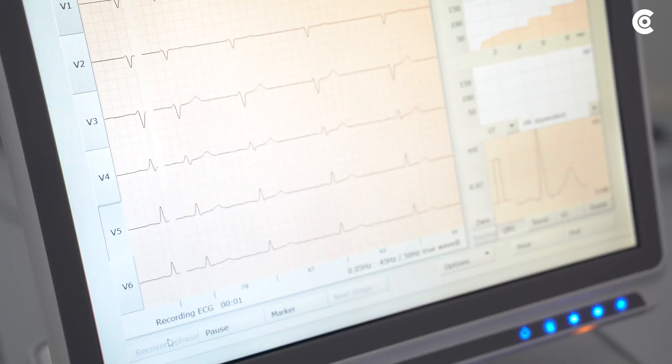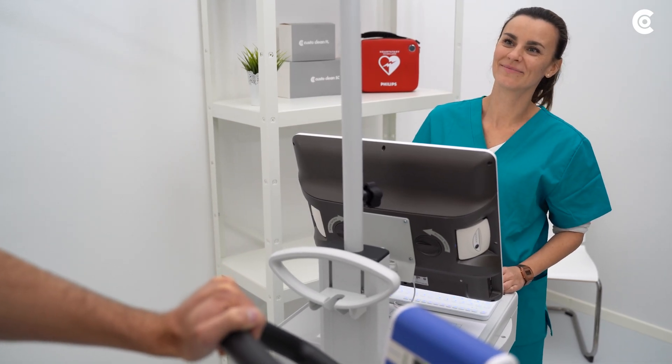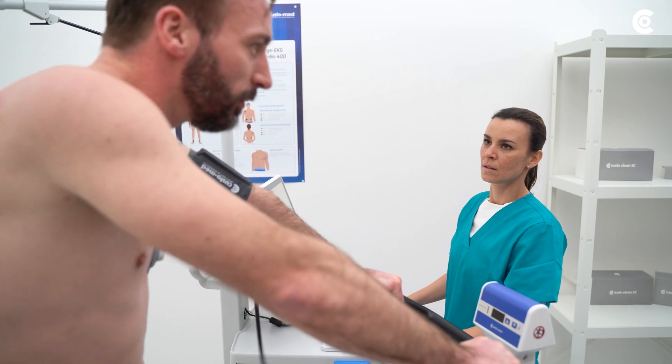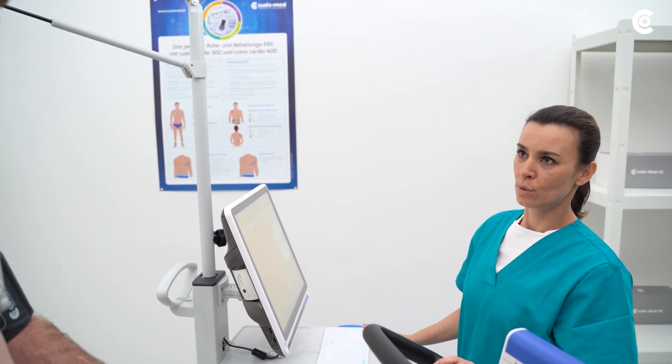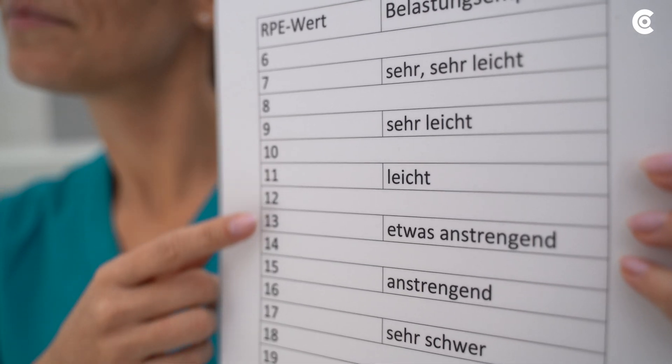Then start the examination and guide the patient through the individual phases. Always take care of the patient's condition and values. Interrupt the process with upcoming overload of the cardiovascular system as well as other indications of over-straining. Conduct the interrogation according to the Borg scale during the measurement.